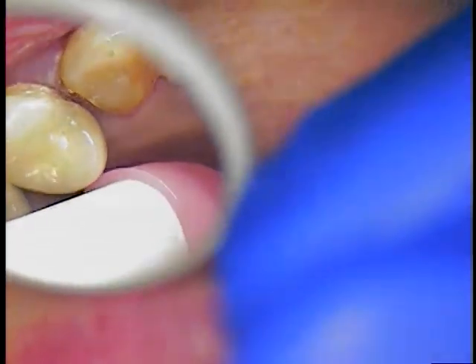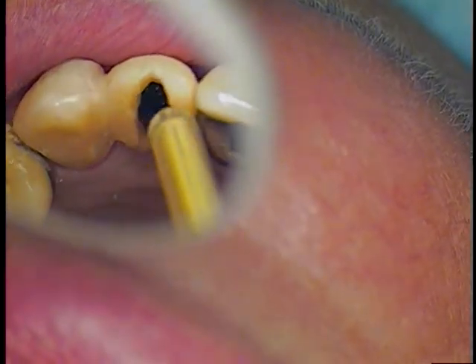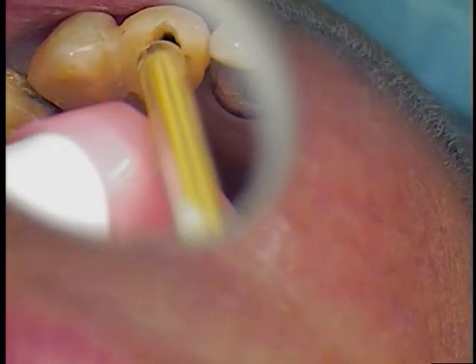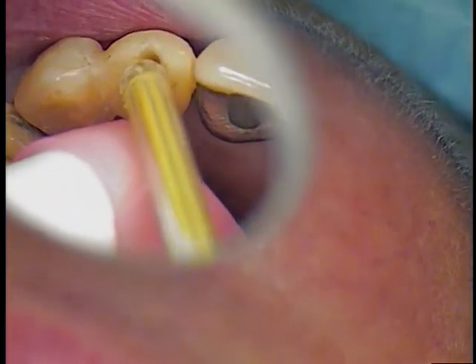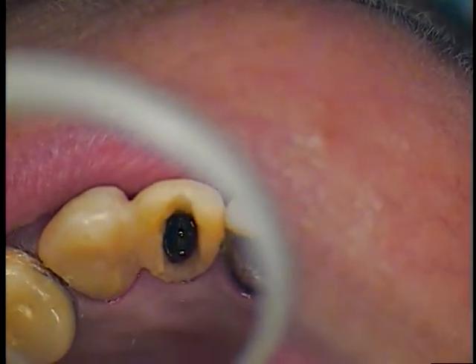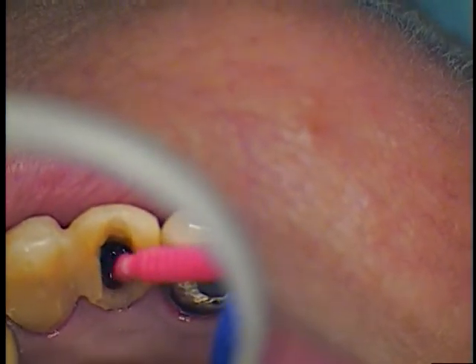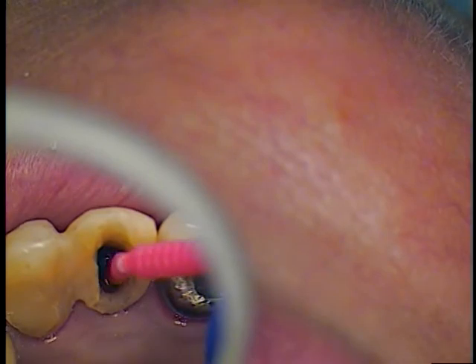Okay, so I'm way down inside working it. I'm just working it. And I'll show you what we have. See that brown? That's not quite all blood. That's just, here we go. I'll take another micro brush. We haven't gotten to the abutment yet. Abutment's in there. But we'll go after it another day.